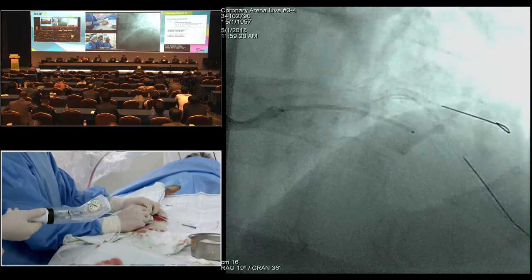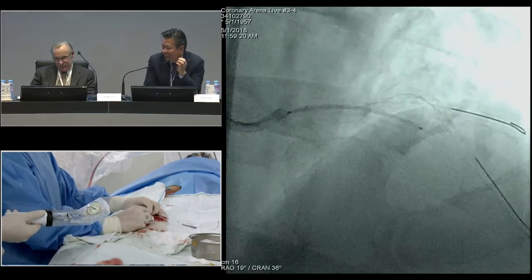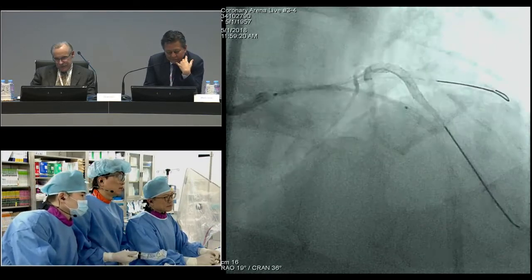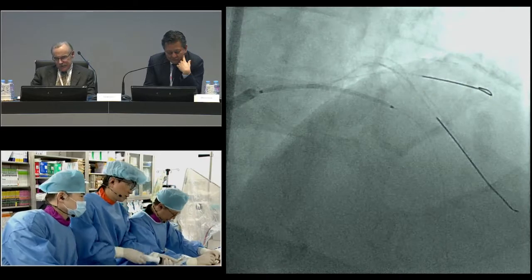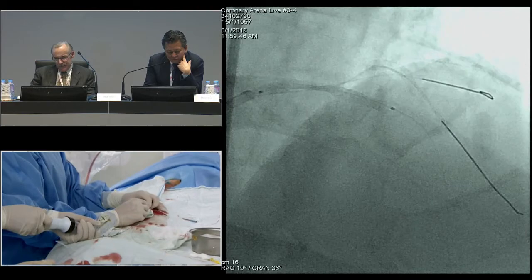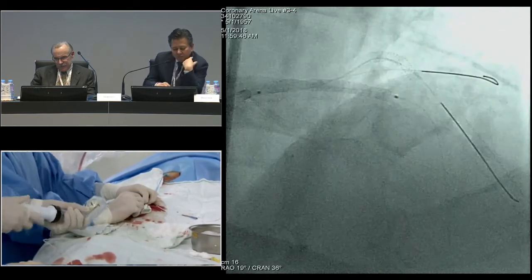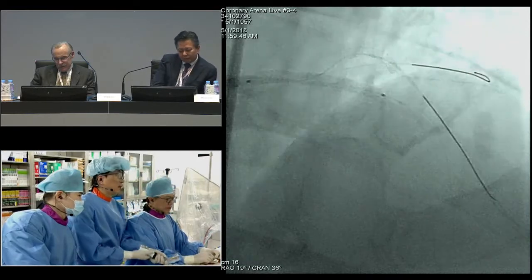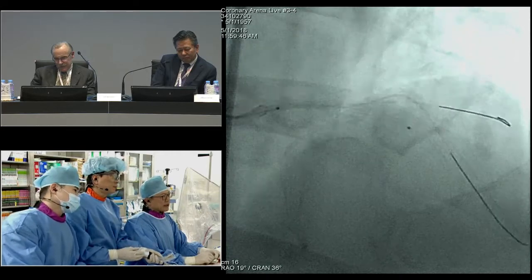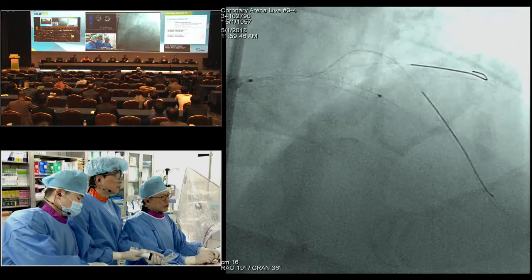What is the reason why you go to direct stenting instead of pre-dilation? Because it doesn't look that tight in any particular area. Looks good. Go ahead. 11. Slowly. There's a plaque there, you can see. I normally dilate the left main and get it open a little bit, but it looks like pretty soft plaque and pretty focal disease there. So I decided to go ahead and just do that.